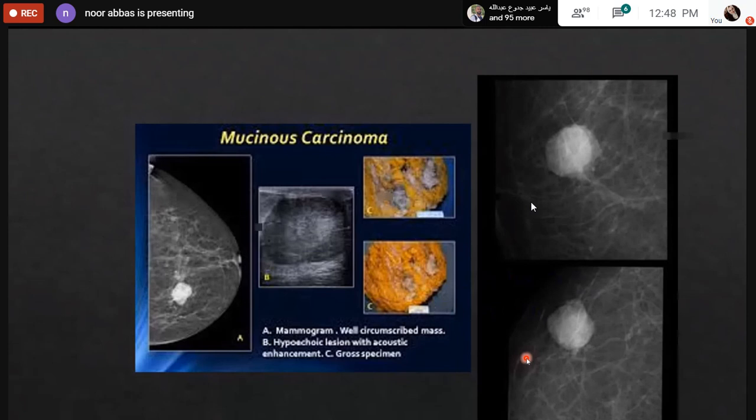Always refer to the specialist and his subject. Benign lesions generally have well-defined borders and homogeneous internal texture. But if it happens, on the ultrasound picture, malignant lesions are generally irregular, poorly defined, interrupt the normal fascial plane, and have abnormal internal vascularity.